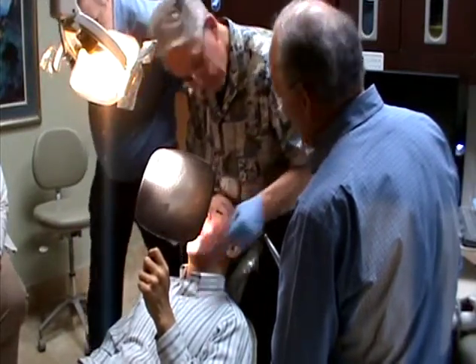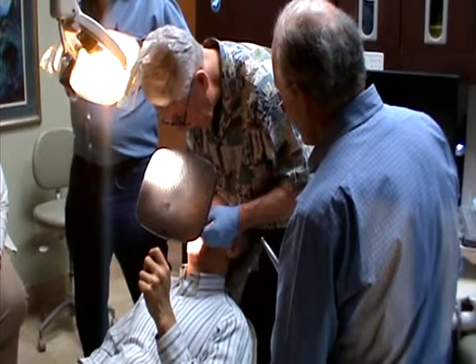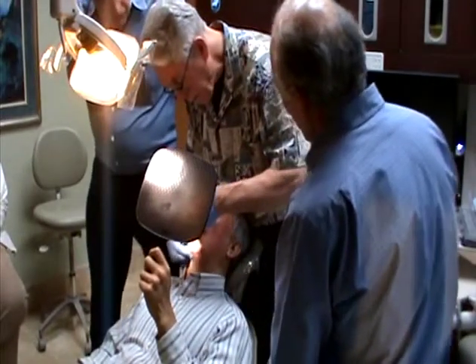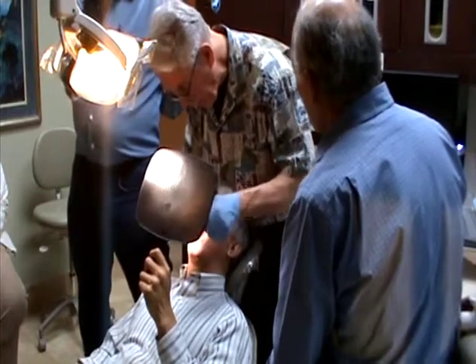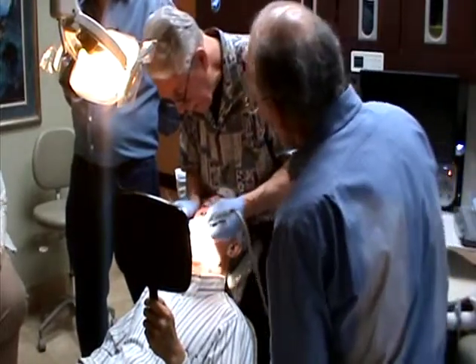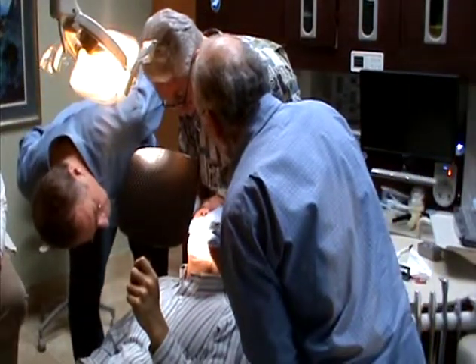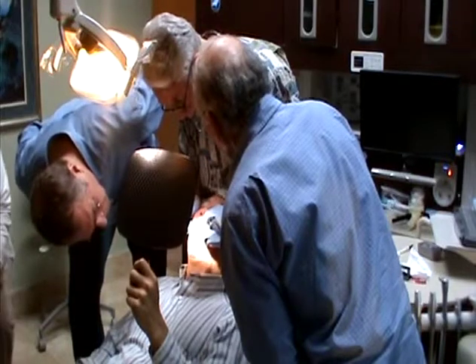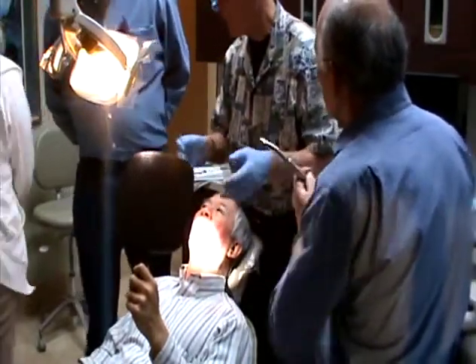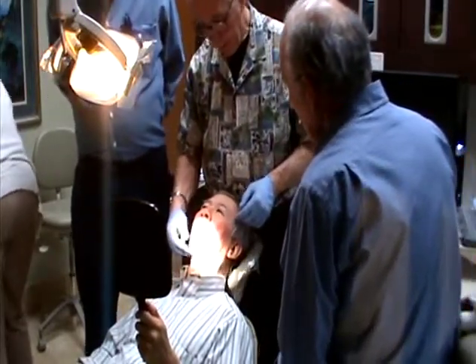Okay. There's the green one there. We're keeping our centric stops in the middle here now. Is that a two-surface gold foil? Looks like it's been gold. We're in the centric stop, these are really fine little ones. So you got your balancing interference there, or what are you working on, centric stop? I keep my centric stops and I can slide him without his back. Yeah, working on balancing interference. Now it should slide. Maybe he doesn't need the appliance.